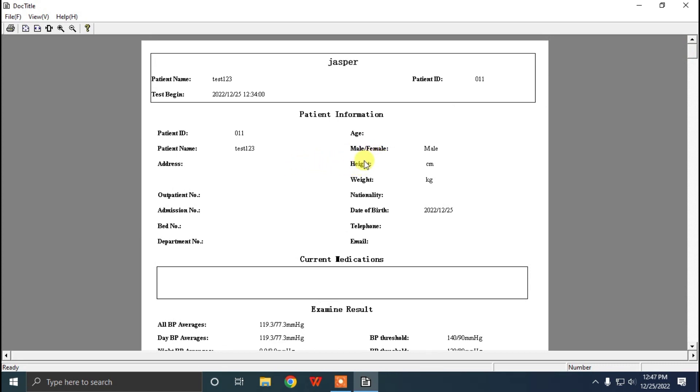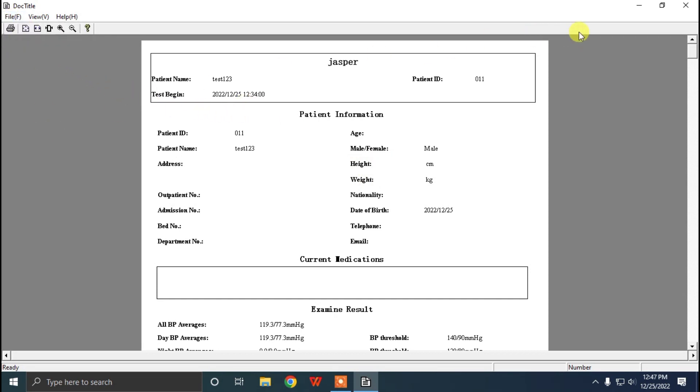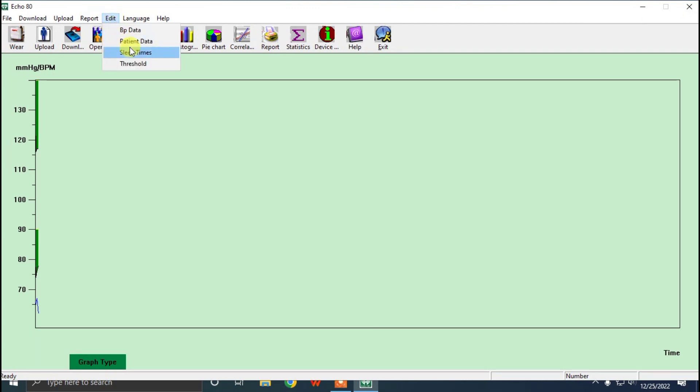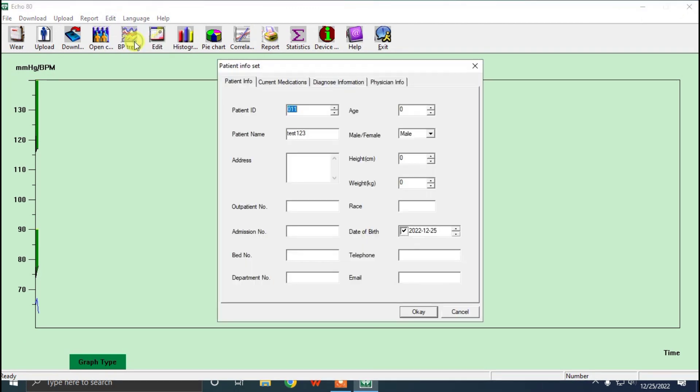Here you can see the gender, height, weight. For that, we can go and edit it. We can go to edit and patient data. Here you can see you can change age, male, female, height, weight as you required.